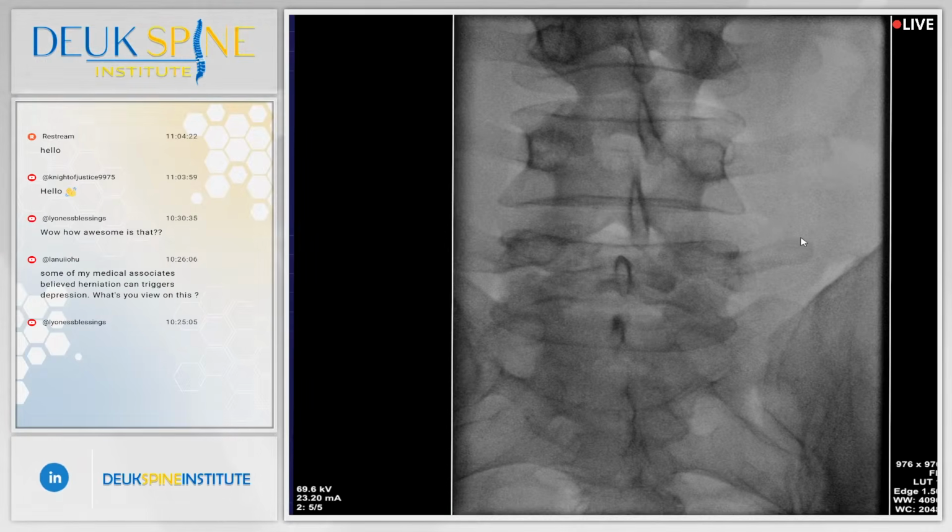You can see, show the vertebral body. We're looking front on to the spine. Show the pedicles, left pedicle of L4, right pedicle of L4, transverse process coming off the pedicle and facet. And then you got the 4-5 facet on the right side, just down below. Right there is the 4-5 facet. And then the 5-1 facet below that, further down. So we got those two facets to treat, and then we got the SI joint.